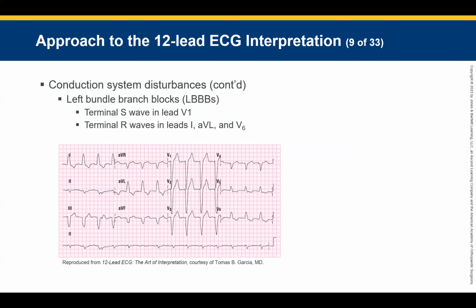This is sprinkles, guys. We got our 25 or so base rhythms on that other sheet that we've hit the last few weeks. This is the extra stuff on top. Have to have 12 lead to get to this. Gotta be able to look at V1. We need to know that QRS duration or measure that QRS duration.